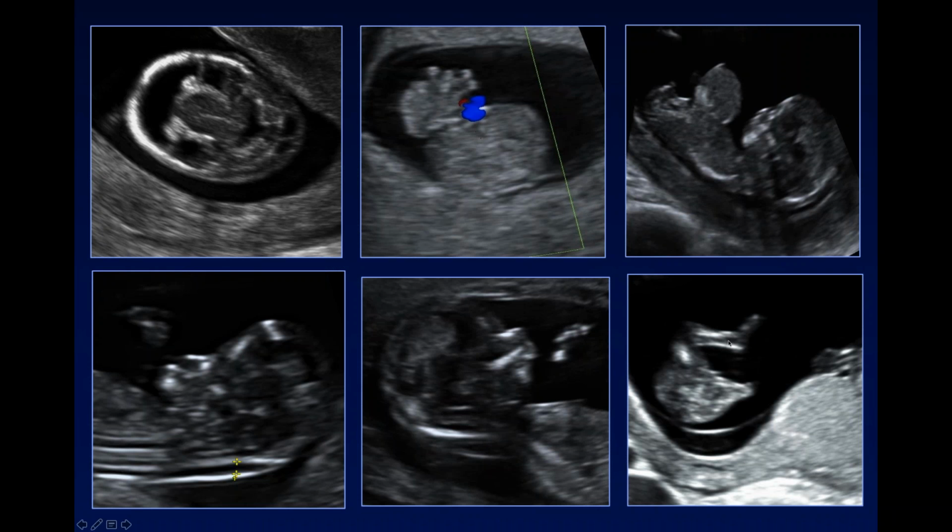In this case, this fetus has one normal lower extremity, but has a transverse amputation defect of the other lower extremity. And it is easier actually to look at the extremities in the 11 to 14 week gestational age window than it is at the time of a second trimester anatomic scan, where the fetus can be doing a tricep extension or having its hands hidden behind it. Much easier to see in the 11 to 14 week window.